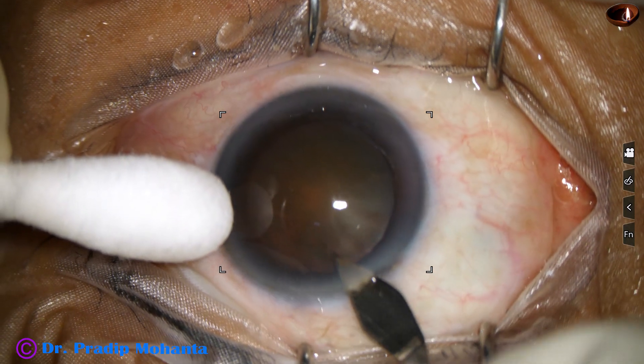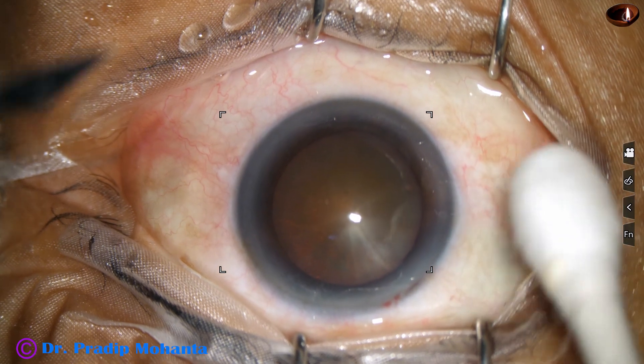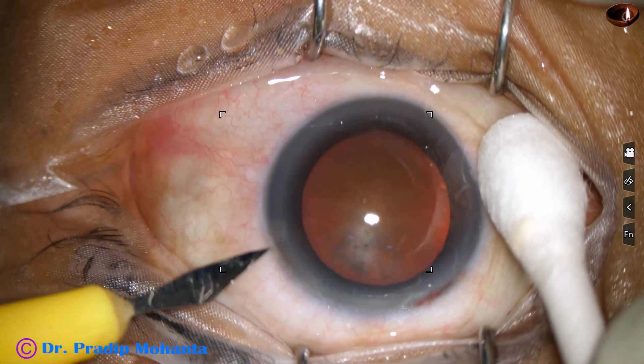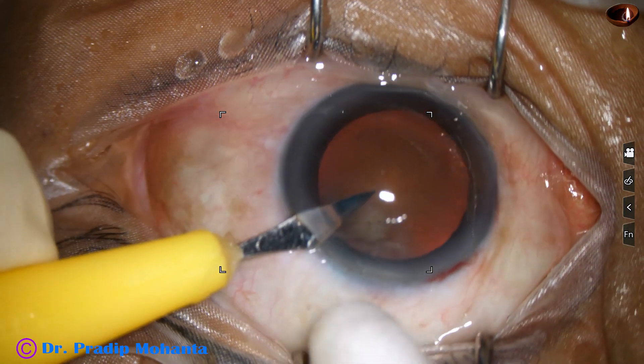The main incision has been made with a 2.8 millimeter steel keratome. And now a side port is made about 3 o'clock away from the main incision on the left side.